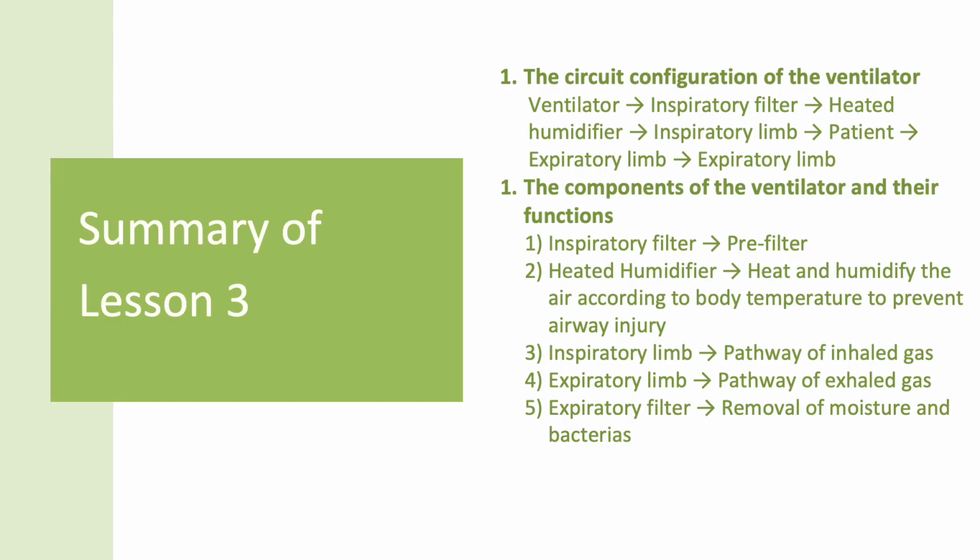This is the end of Lesson 3, Circuit configuration of the ventilator. Make sure you've mastered the basic concepts before you move on to the next level.